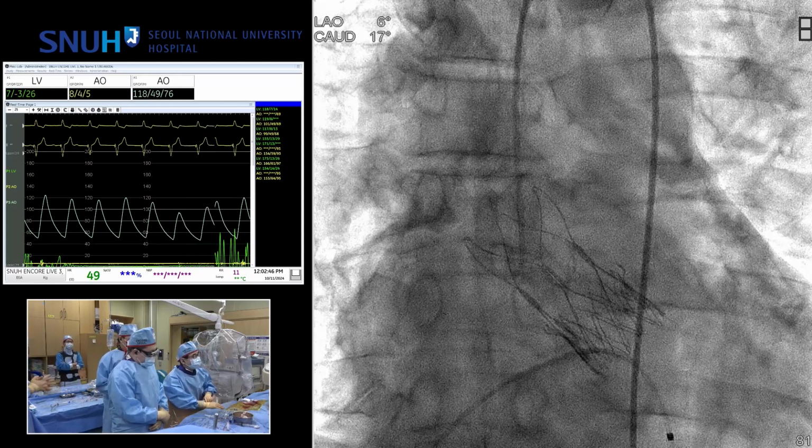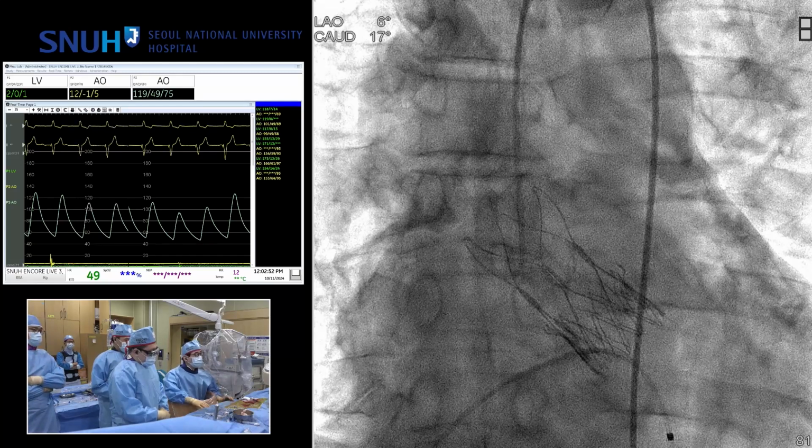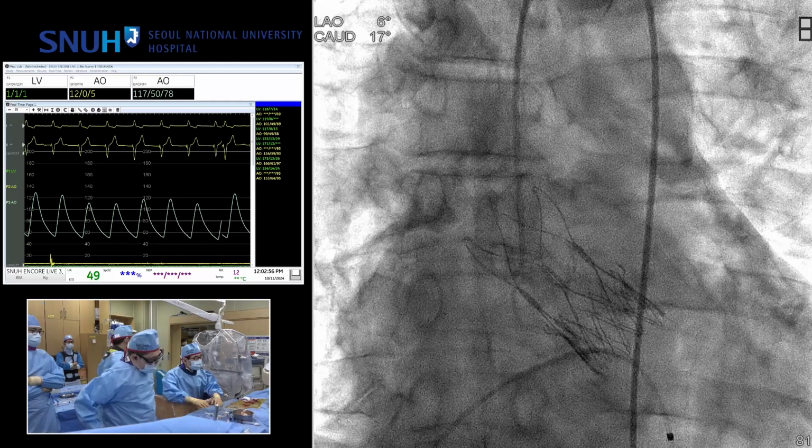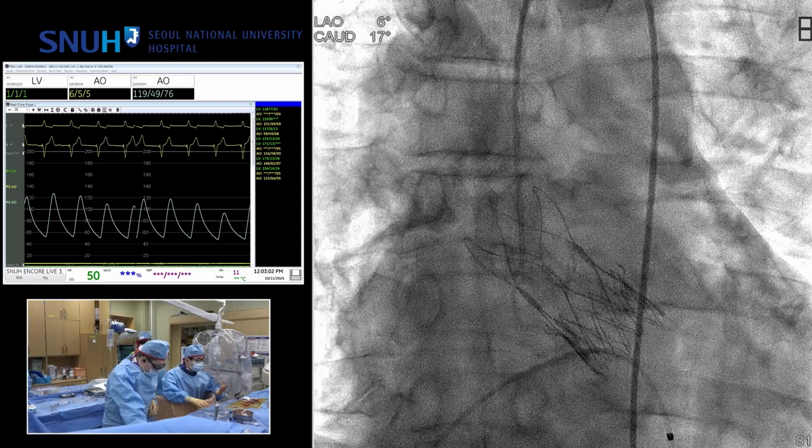If coronary angiogram fails, it should not be a serious problem. So when do you return? 10 minutes later? 100% done. So we don't want to waste time to see that. No, we'd like to move. I have a right to do it. Okay, live for 45 minutes, okay?